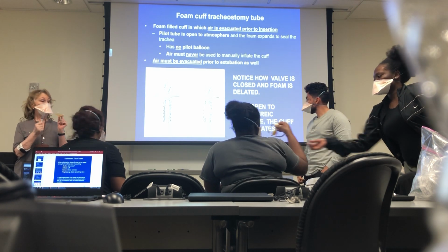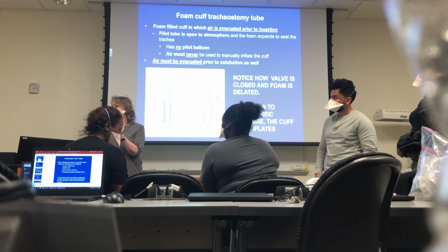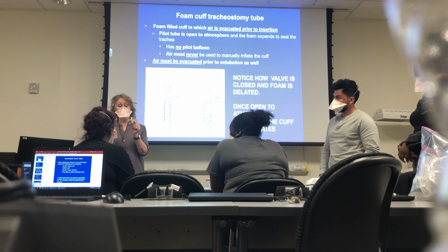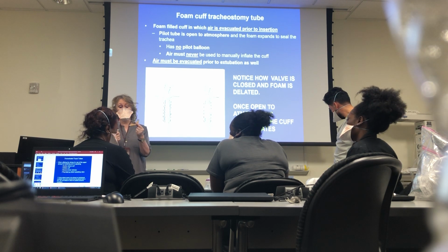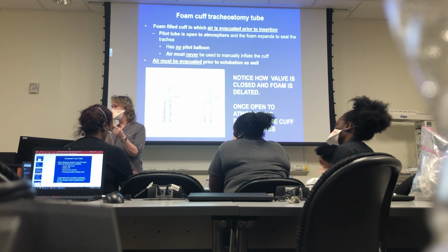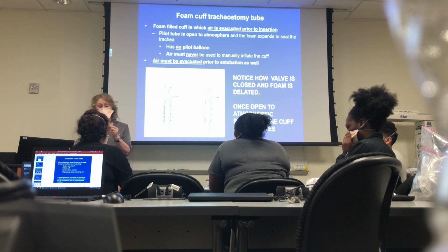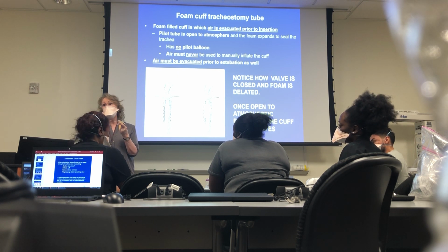Now, when I first came out of school and worked at the hospital center, nobody ever taught me about foam cuffs. And I went in there, and I am trying to figure out how to measure pressure. Number 1, you can't. How to put air in the cuff. Number 2, you can't. Number 3, I'm like, why is this open? So I closed it. Not good.